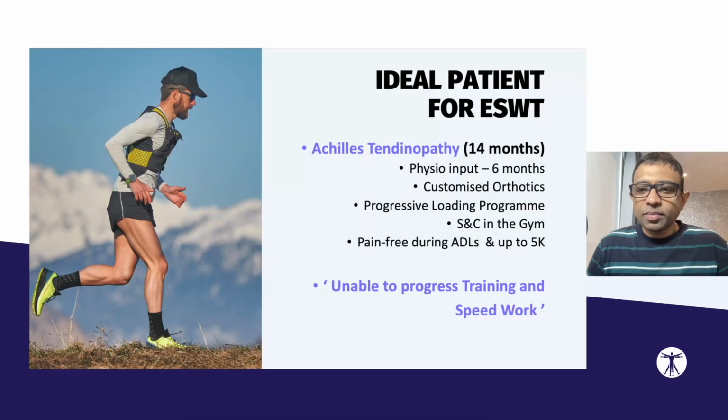So this is sort of a patient where I would really suggest Shockwave, because he has tried everything. It's not massively irritable. His symptoms are stable, but he's not able to push into the next level. So this is sort of where we have to think of options beyond traditional loading protocol.